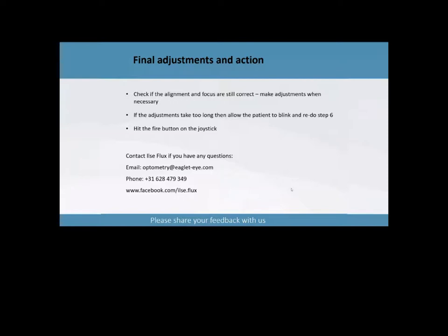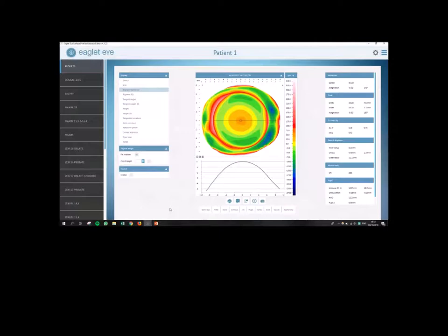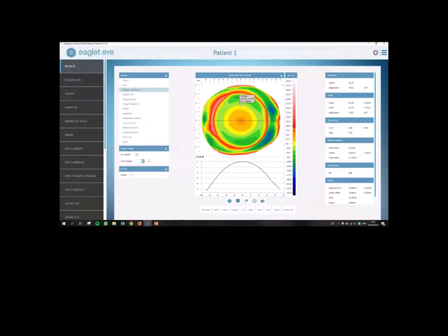Over my screen right now. And I'm going to show you how it looks when you actually get a measurement. So after you've done those three steps, you've taken a measurement, an image like this is going to show up. This is what we call the Biosphere Elevation Map. And just remember, it's Sagittal Height. So the thing you see over here is Sagittal Height and not Curvature.